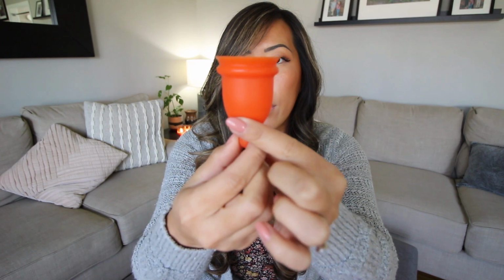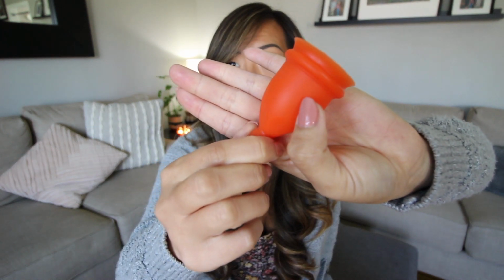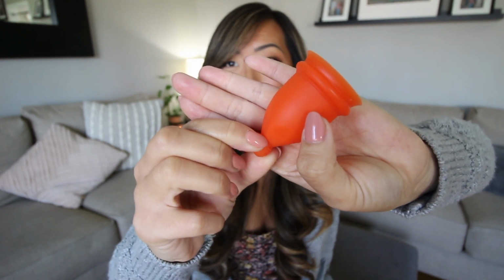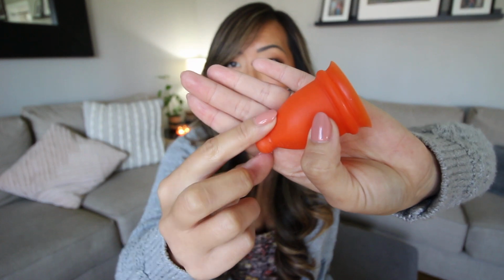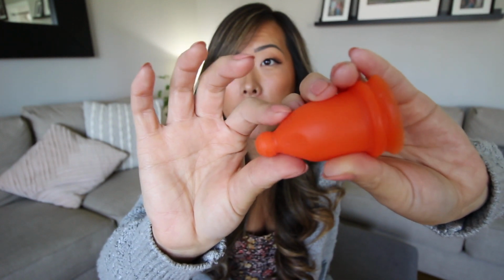The shape of this cup is very similar to most cups. The difference is though, however, the bottom right here, instead of being completely smooth, you can kind of tell, it almost ridges in like facets, like a diamond kind of goes smooth then round, then smooth then round. There are a bunch of different smooth with little grippers, you can kind of see it better there, where you can really grasp onto the cup and pull it down and get it out to break the suction.